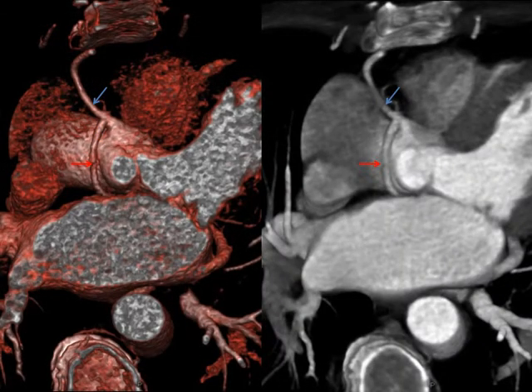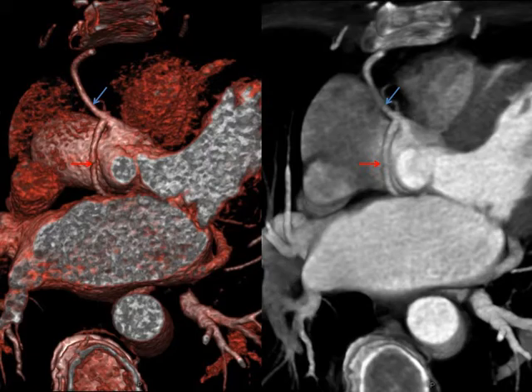Color and grayscale volume rendered images again demonstrate the RCA and left coronary artery sharing a common trunk arising from the right sinus of Valsalva.